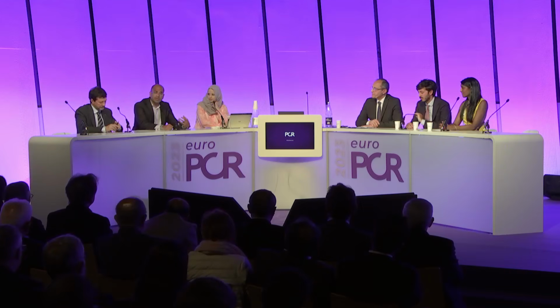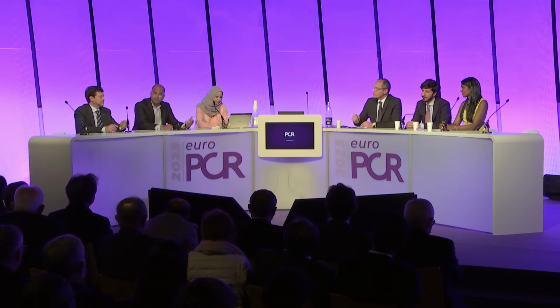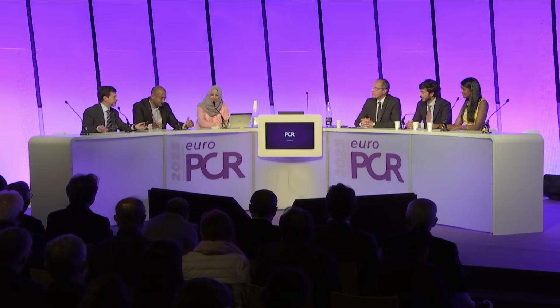Yeah, I would agree. I just say for operators that are not used to doing a lot of this, there's a lot of things going on. So I actually think that for operators that are starting off, there's nothing wrong with putting in the pacemaker just so you can focus on the things that you need to focus on. Experienced operators, we don't typically do it. But to start off, the last thing you want in your first rota case is asystole and heart block, which happens rarely, and then it'll prevent you from saying, I want to do a rotablation ever again. That would be a mistake. No, of course, unless you start with a patient with 25 ejection fraction, LBBB, and advanced AV block, something will happen. But except if you have normal conduction, you don't need it.